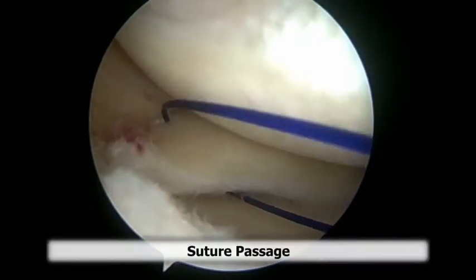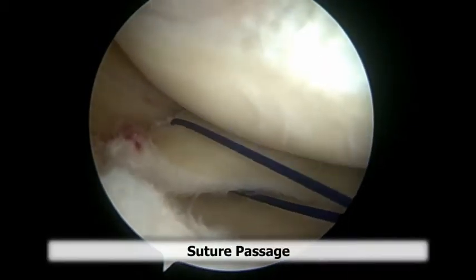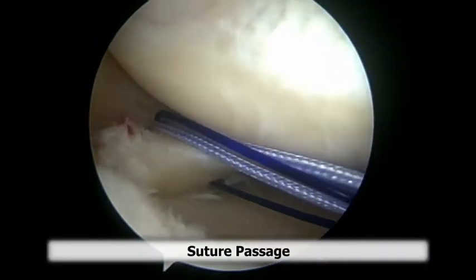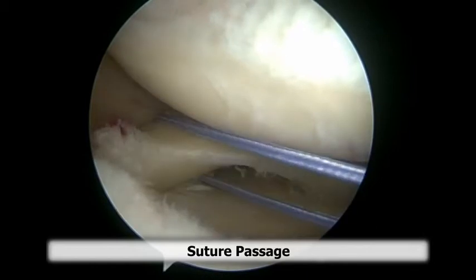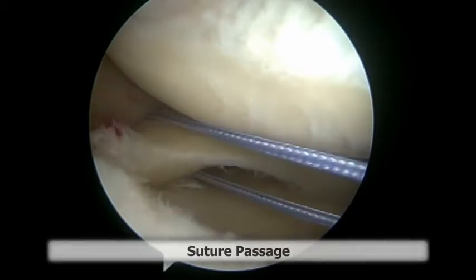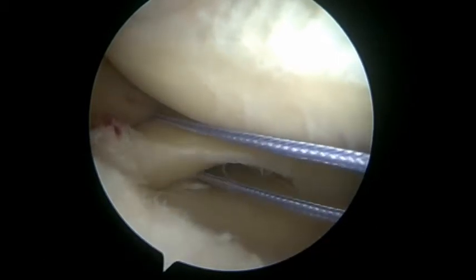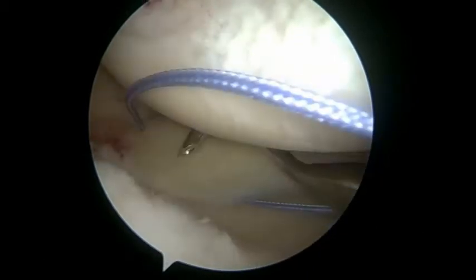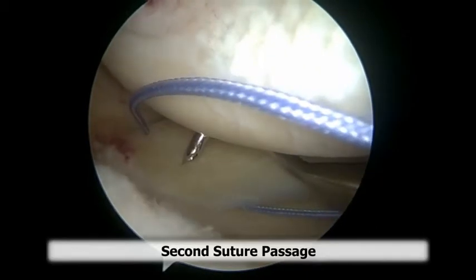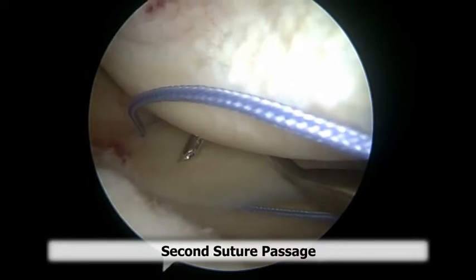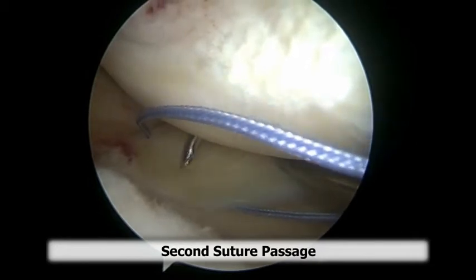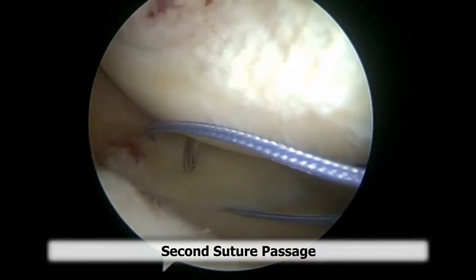The free end of the PDS is then tied around a high strength polyethylene suture, and the other end of the PDS is pulled, shuttling the high strength polyethylene suture through the meniscus tissue in standard fashion.